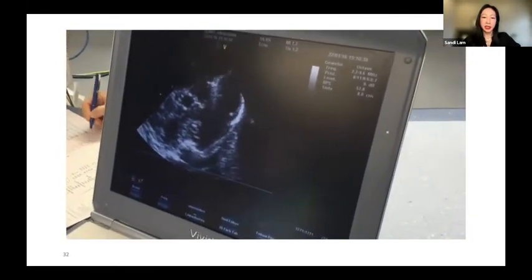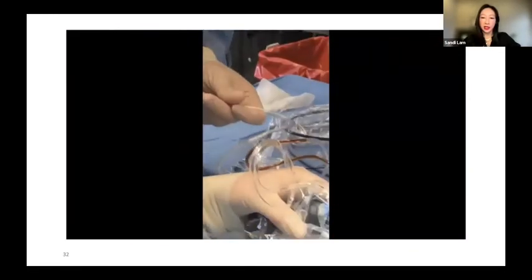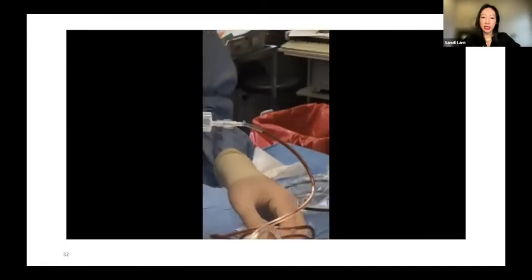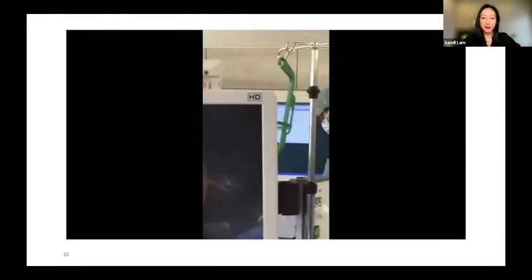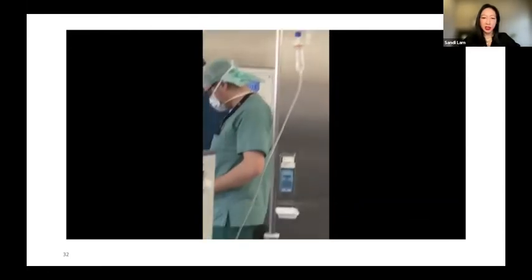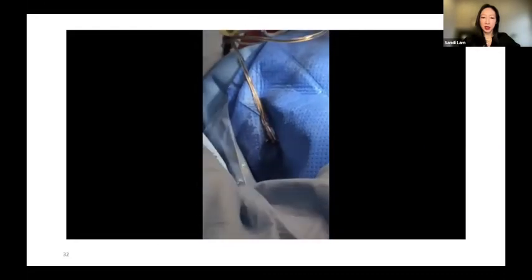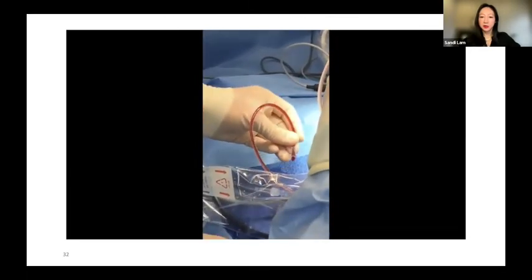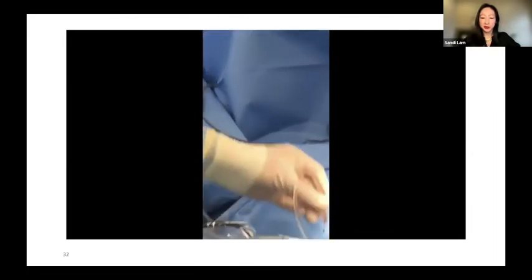using the ultrasound, you'll see that it's guided into the ventricular space, and then managing the inflow and outflow. And you'll see the outflow here, and you'll see that kind of motor oil quality of the CSF mixed with the intraventricular hemorrhage, and letting that out. And you see the view inside the ventricle is really not that great at first. And you have continuous irrigation to irrigate out this xanthochromic fluid. And over time, you'll see that this actually clears up, and you'll see some of this blood clots coming out. And then you see the view actually gets more and more clear.